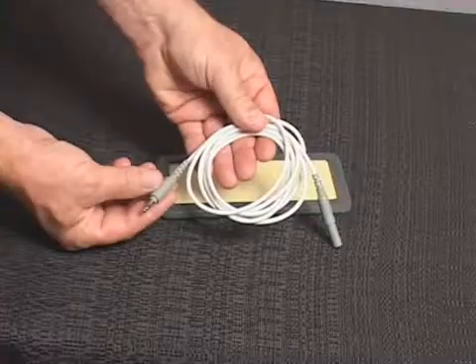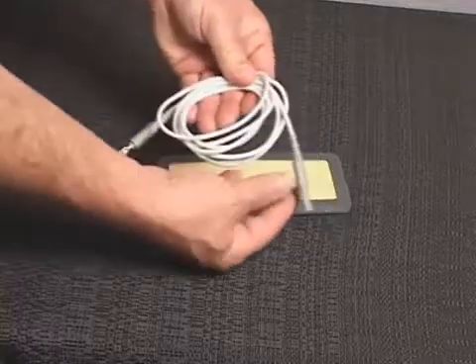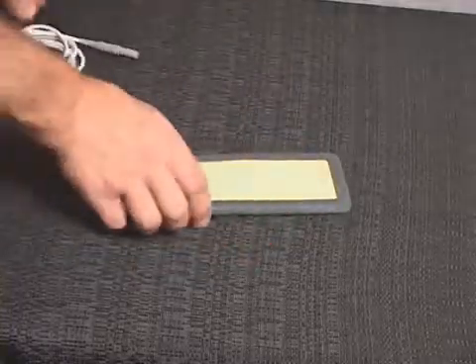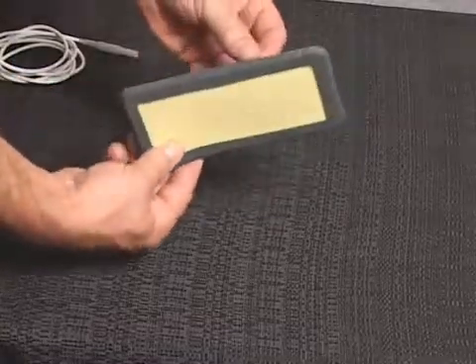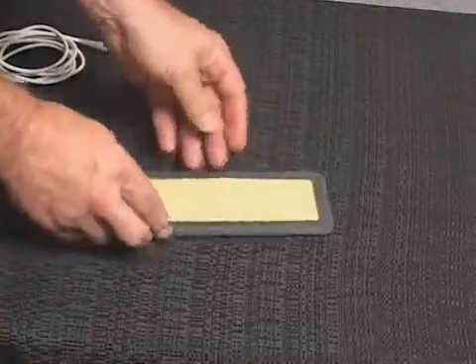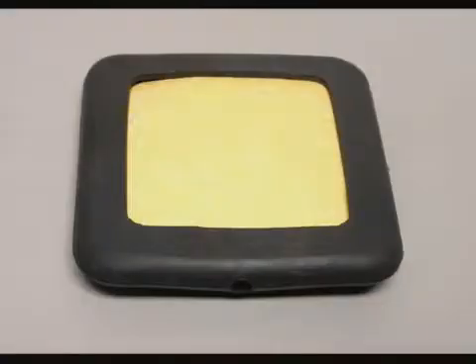The patient leads should always be checked for proper connection and damage or deterioration prior to treatment. Loose connections or damaged cables can cause low stimulation output, no stimulation output, or sudden irregular increases in output resulting in possible discomfort to the patient. The treatment site and electrodes should be cleaned and properly prepared prior to application of electrical stimulation to the patient.